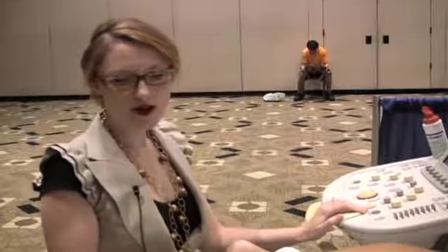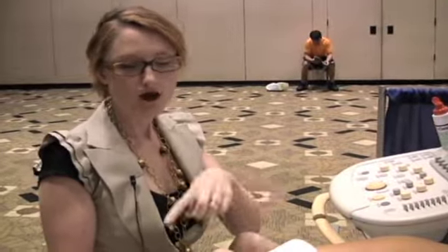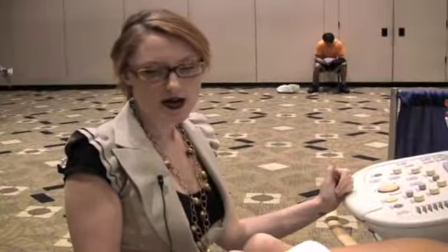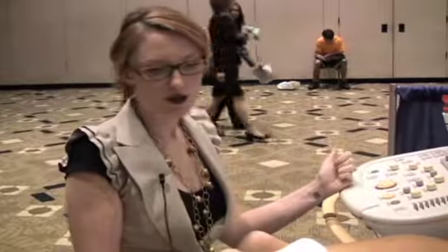So this is a modified foot and ankle ultrasound. The foot and ankle complex is incredibly complex, and people need to really be guided by patient symptoms. I don't want to go ahead and cover everything in foot and ankle. I need everyone to be aware of the fact that there are so many structures that are possibly affected. I'm just going to cover the major structures and the major things that can potentially go wrong in the foot and ankle. But again, like at all areas of ultrasound, you need to expand your study according to patient symptoms. So that's really important to be aware of.